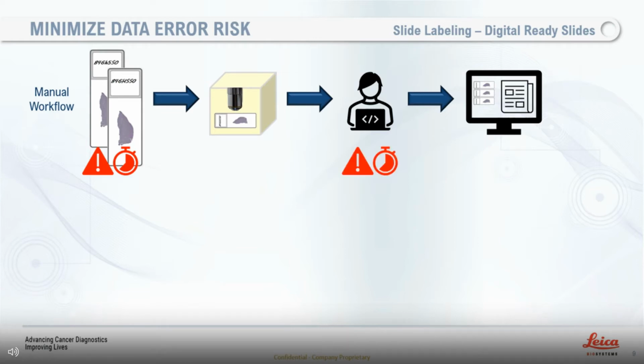you have your slides scanned, how are you going to create, in a manual workflow where you have handwritten slides, you're going to manually have to create that association between your digital slide coming off your scanner and your database, whatever format that might be in. And this requires significant data entry.